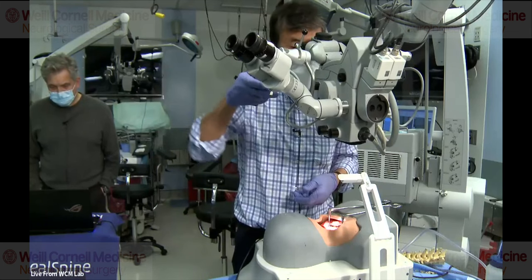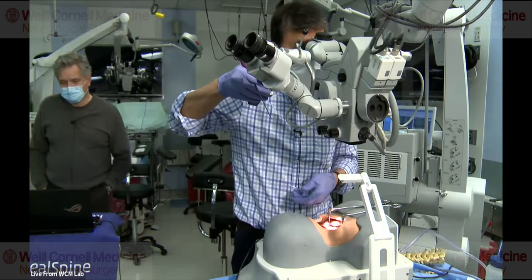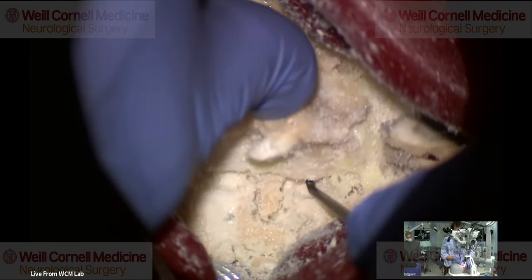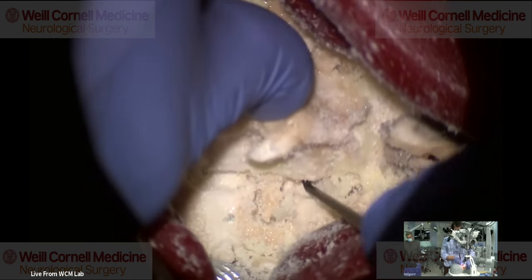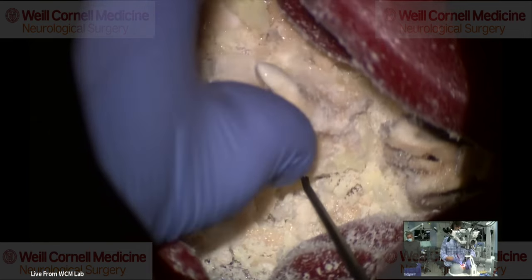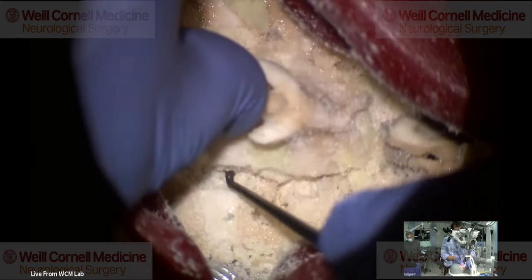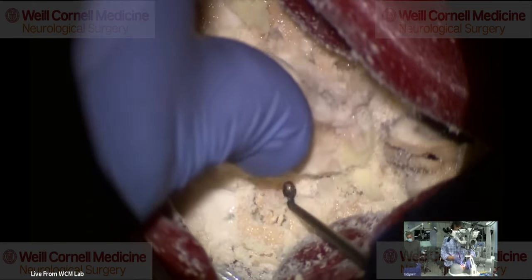And then what I do is I take a curette. Let me zoom back so you can see. I put my finger on the spinous process and put a curette under it. That way, if my finger slips and it snaps shut, my curette catches it, and if the curette snaps, then my finger catches it. It's belt and suspenders. So I lift it up. Whoop, I guess it is a little brittle. So I do one, and then I would go and do the other.